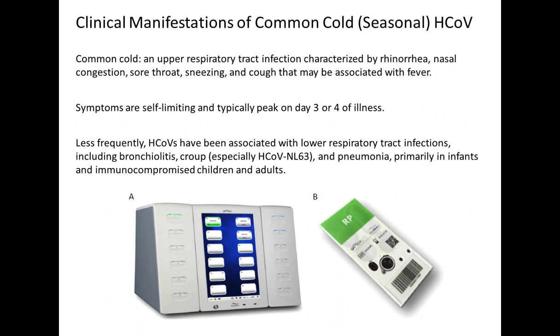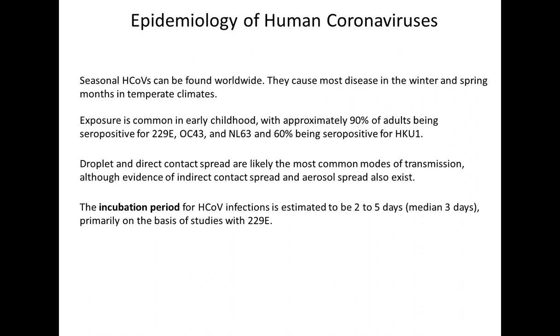And if you look in laboratory medicine, so in my own lab, we use a respiratory pathogen panel that's actually able to diagnose this, because in our transplant population, it's critically important to diagnose patients with this disease.